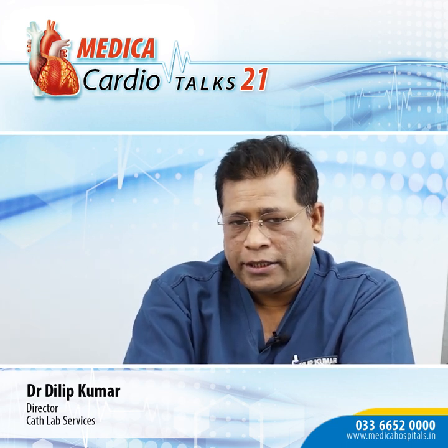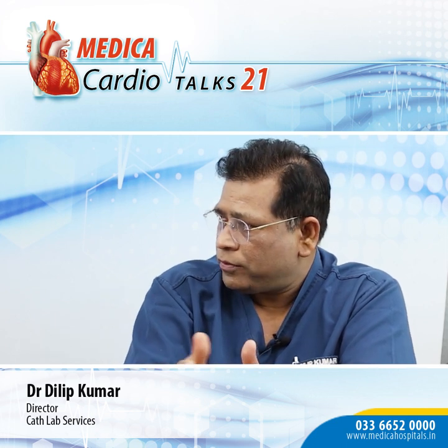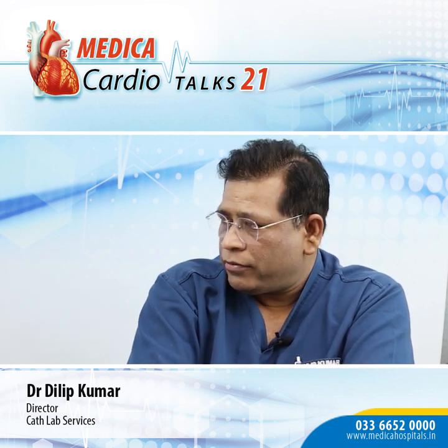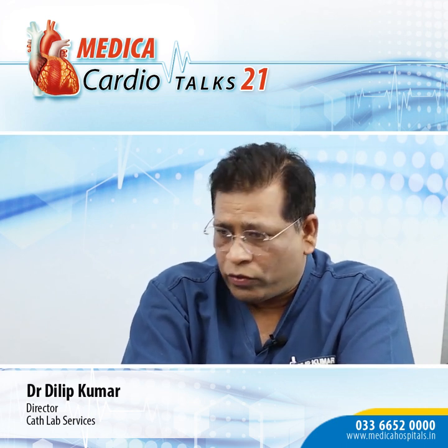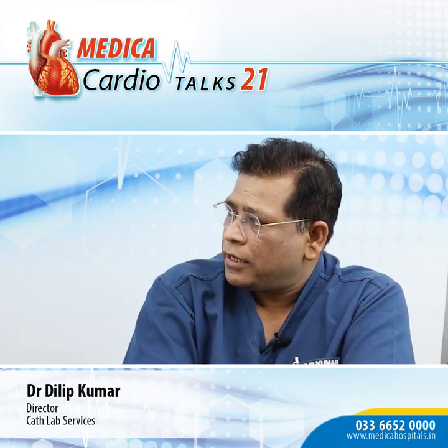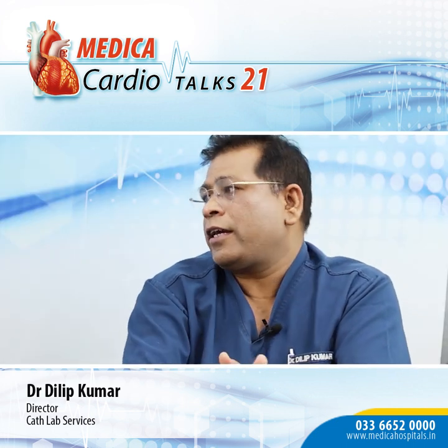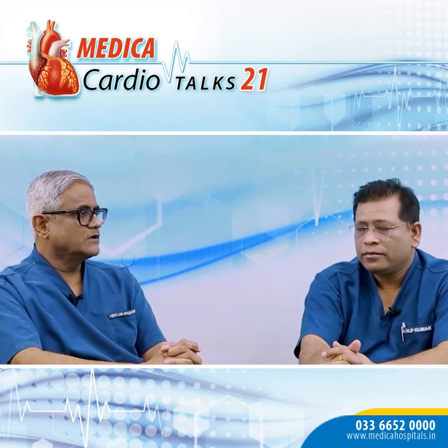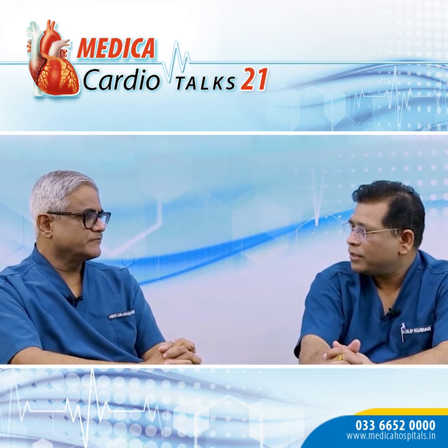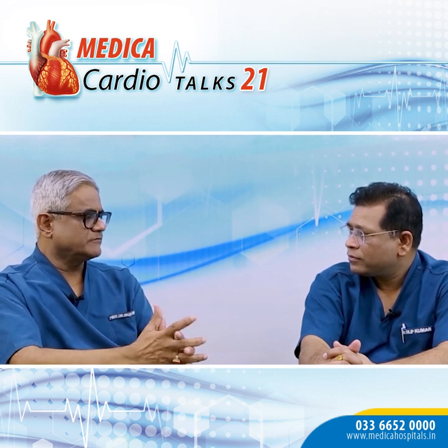The rest of the devices don't have very clear and good evidence for us to jump on these devices. The future looks like these devices will further refine edge-to-edge repair devices. Sure. So I think a similar fate is waiting for TriClip and tricuspid valve edge-to-edge repair. So there is a future of tricuspid valve repair, unlike surgical valve repair.